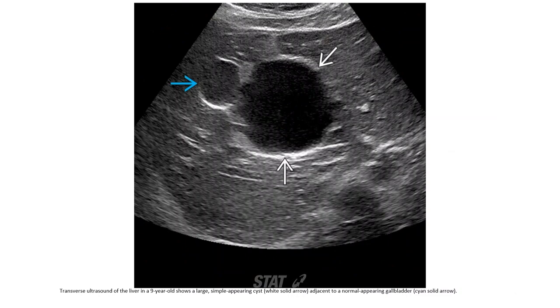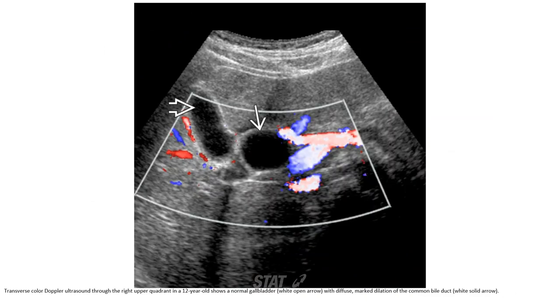Ultrasound of the liver in a nine-year-old shows a large simple-appearing cyst adjacent to a normal gallbladder. Ultrasound through the right upper quadrant in a 12-year-old shows a normal gallbladder with marked dilation of the common bile duct.